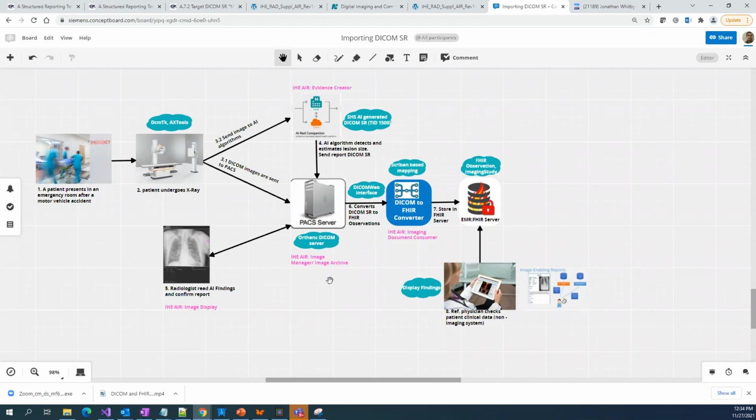This is also one of the tracks where I want to have a brainstorming to come up with the flow. Originally I proposed two workflows. One is the AI workflow, which we are much clearer about with respect to how we are interacting. The second is the ABDM workflow, where we can share the images in an imaging study, and if we can give the imaging study to any of these HIUs, that is also a good option. We will have more brainstorming sessions in the coming weeks.